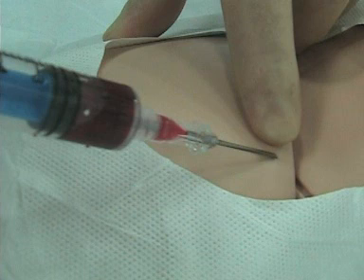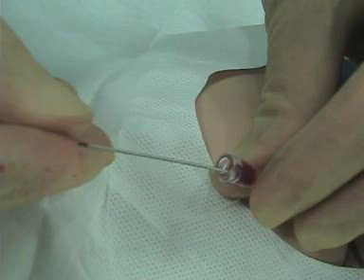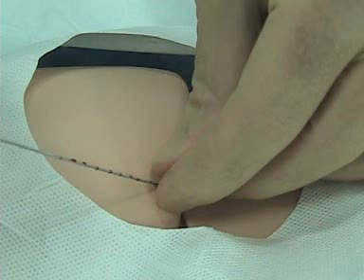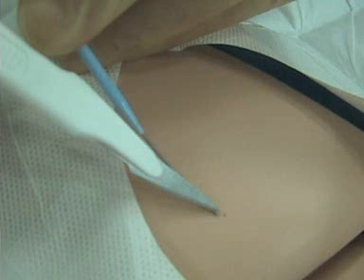One handy thing about putting in a femoral line is if you do screw up and put something in the femoral artery, it's not the end of the world. If you put something in the carotid up in the neck, we have a problem — but not down here. So you get your blood flow, hold the needle carefully, put your wire in. Seldinger technique is the same for whatever line you use. Then you pull the needle out and put in your dilator, making a little nick.